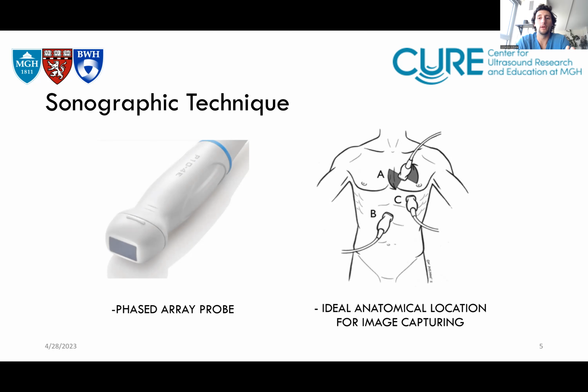You're going to have a few locations for taking your ultrasound. So here's a diagram of what you're going to do. In emergency medicine, our typical probe location on the screen is on the left side. And when it is in that location, I like to tell everybody that is learning transthoracic echo, just put the probe marker at the 4 o'clock position. Say there's a clock on your left chest, and imagine 4 o'clock, that's your first position, and that's going to be your parasternal long axis.